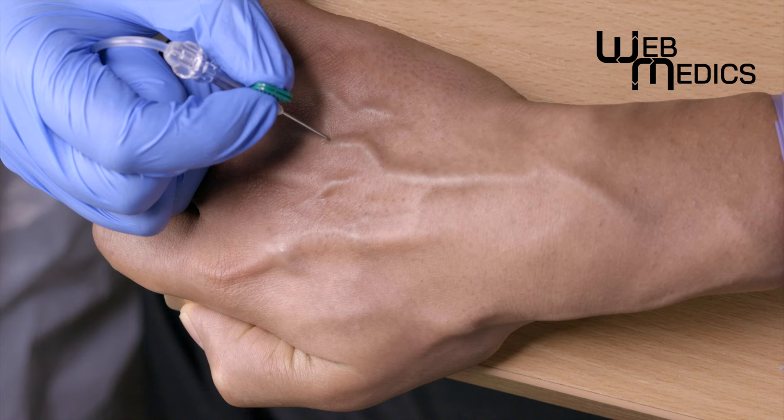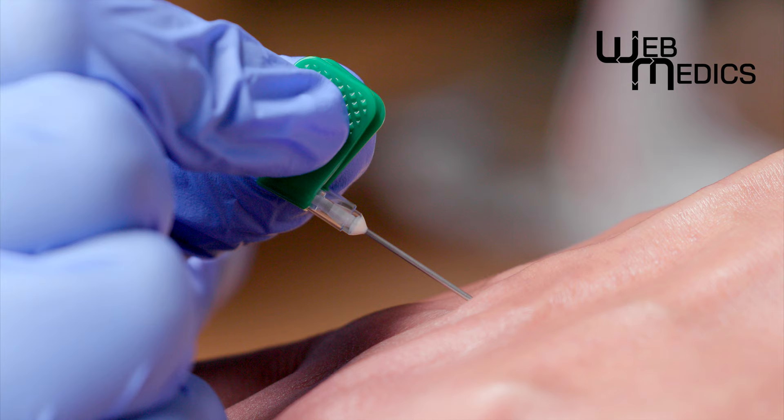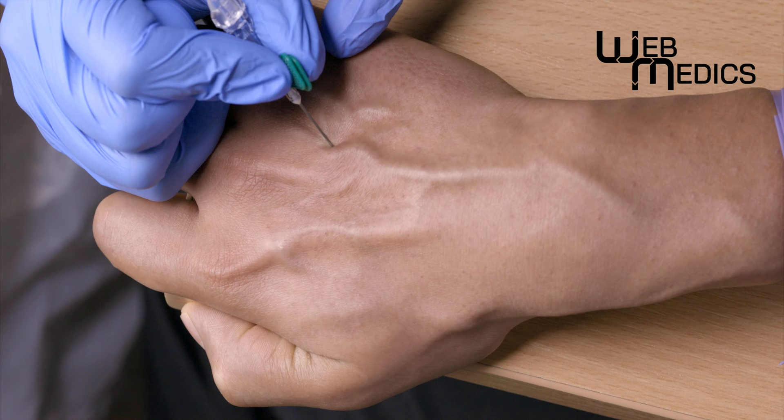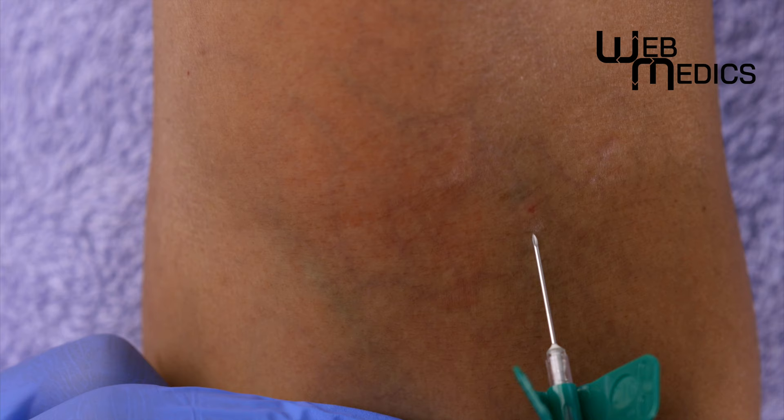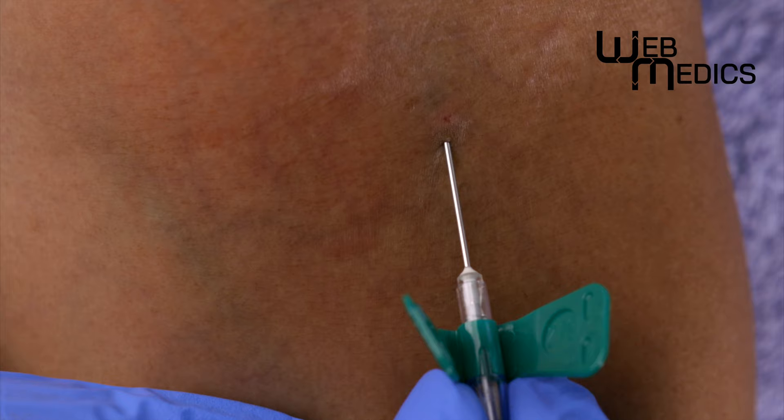Whether it's drawing blood or any important task in life, I don't want to depend on luck, especially when someone's life depends on it. Do you think we need luck? Or do we need practice and technique? Almost everyone should be able to have a successful blood test on the first attempt, without depending on luck in the way I used to when I first started practicing.